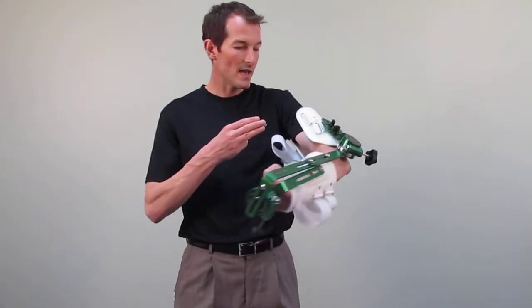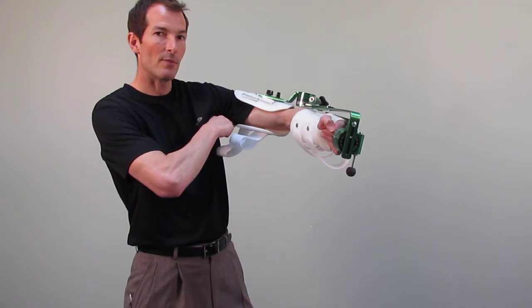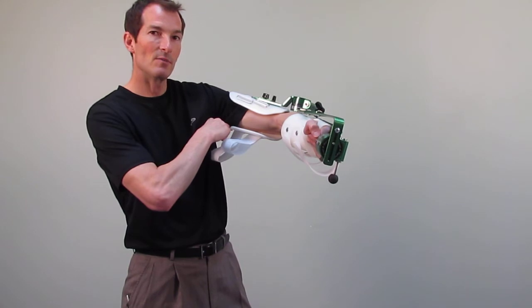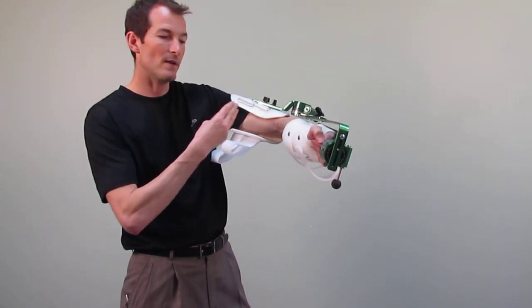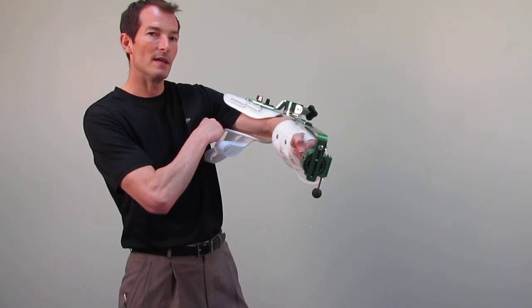You want to follow the same principles that we do when applying a crutch to the patient. We want three fingers in the axilla. The ring finger should hit the top of the proximal cuff and then the index finger should touch the top on the inside of the axilla.